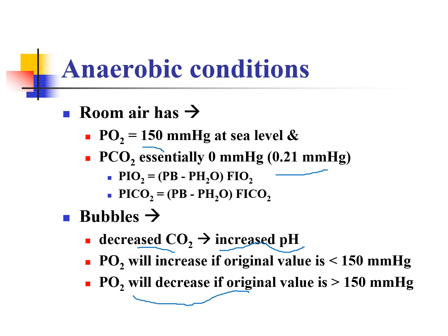If we draw a blood gas on him and his PO2, let's say, is 300, and there's a bubble in there, then his PO2 will actually drop because his value was over 150. It's going to decrease because the value of room air is roughly around 150. So that's what that part is. I wouldn't worry as much about this one. I would worry more about the other one, right? Very rare situations, you're going to have their PO2 above 150.